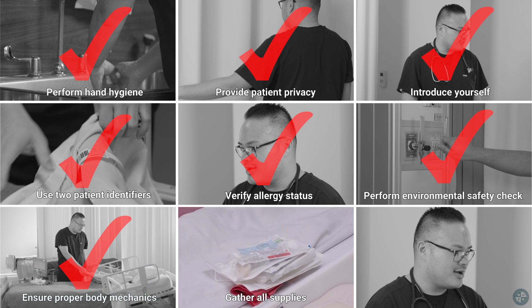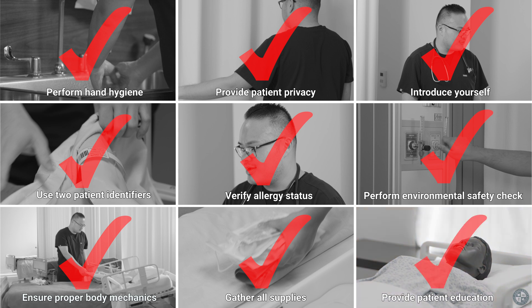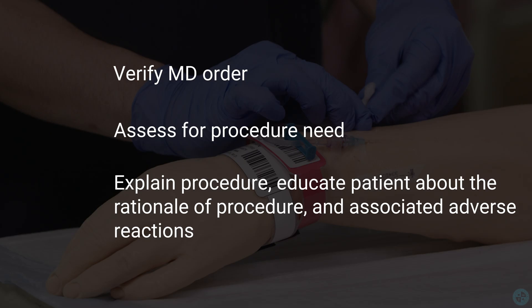Gather all supplies. Provide patient education. Verify MD order. Assess for procedure need. And explain the procedure.